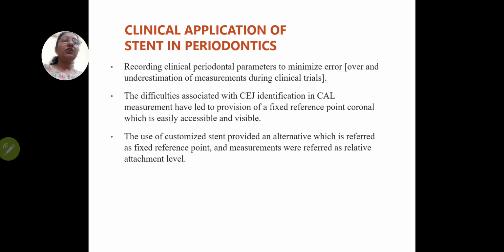Clinical application of stent in periodontics. The clinical application basically is to minimize the error, and the use of a customized stent provides an alternative which is referred to as a fixed reference point, and the other measurements that are there give us the relative attachment level.